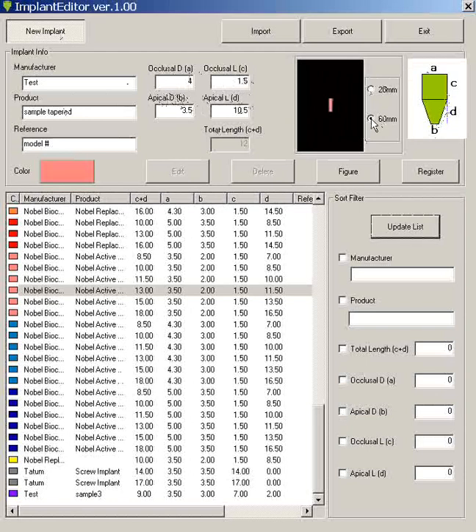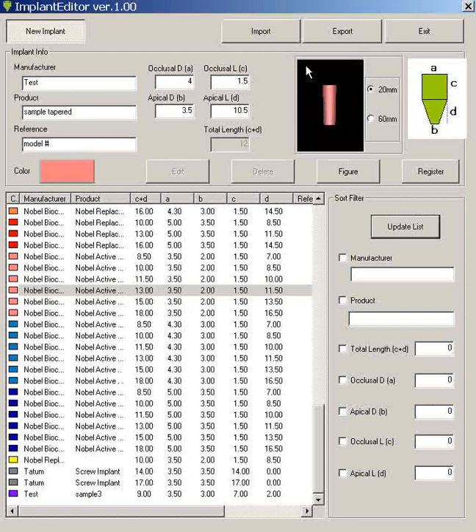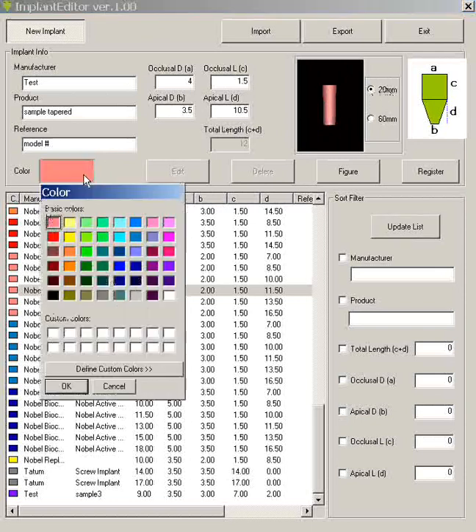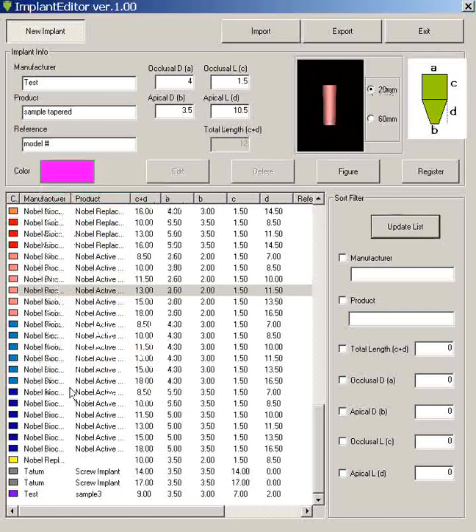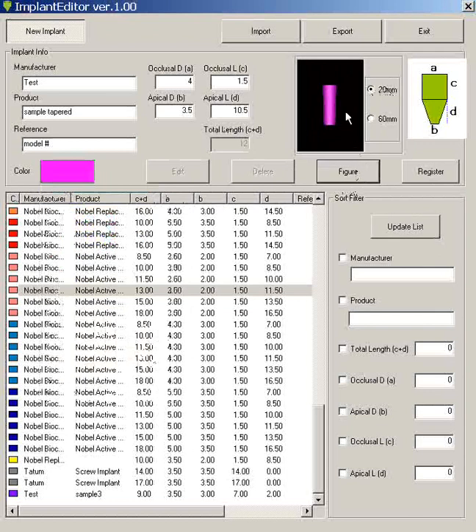By the way, you can just change the scale of size. That's what these two numbers are, 20mm or 60mm. These just make it look bigger, more magnified. That's what that really means. Color, you can change it. You can click on color and you can pick another color that you so desire. And just click on OK and so you have a brand new color. And then you can click figure and then you can click register.